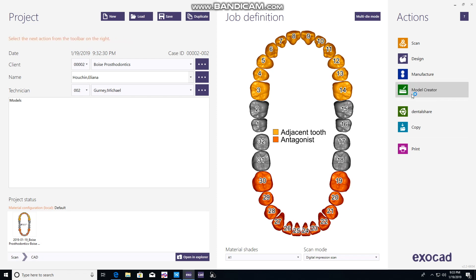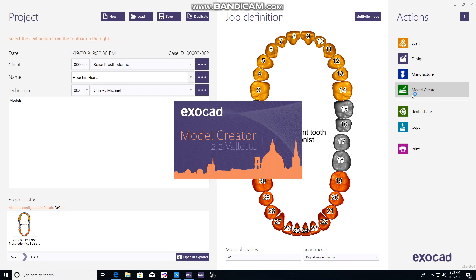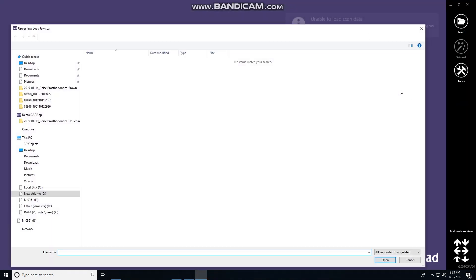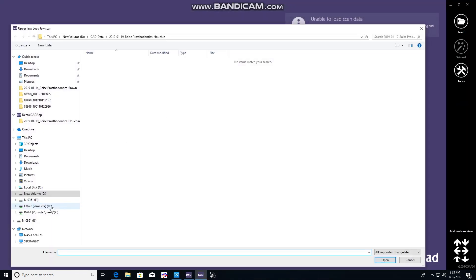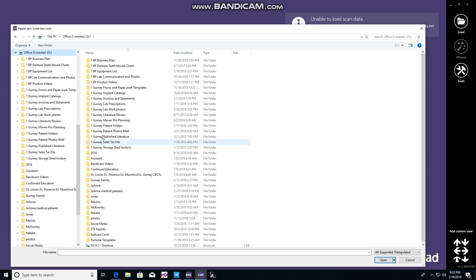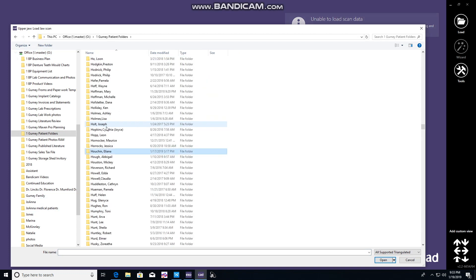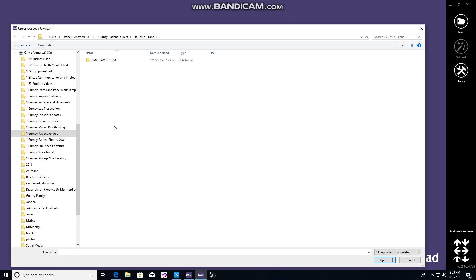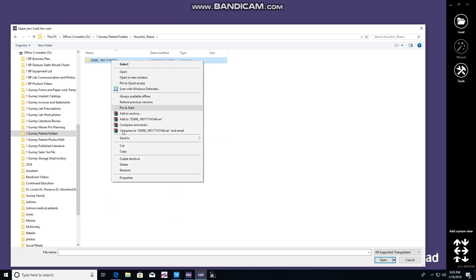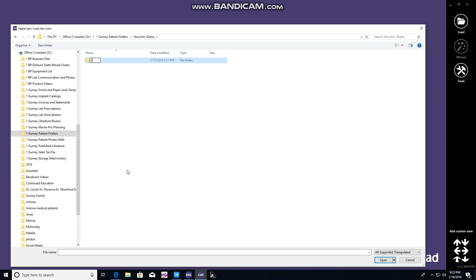It'll think here for a minute and pull up the CAD design. Once that is open, it will ask you to find the digital impressions in our system. We go to the O drive, find the patient folder and the patient's name, as we've saved the digital impressions into their folder. In our office, we rename these to a certain format: 01 Trios Digital Impression and the date that impression was obtained.